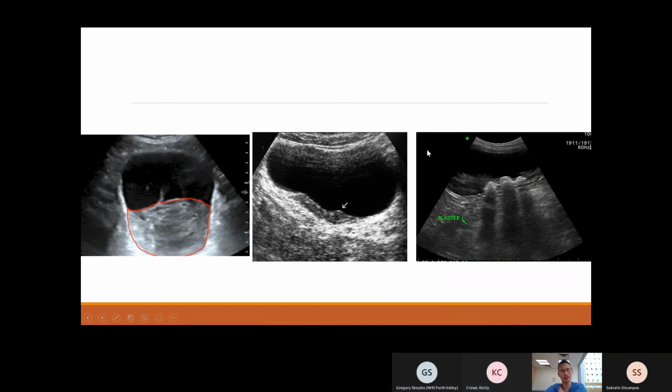And Greg, also, do you want to have a look at this one and see what you think? You mentioned it earlier on, but I'm going to see what you think about this.